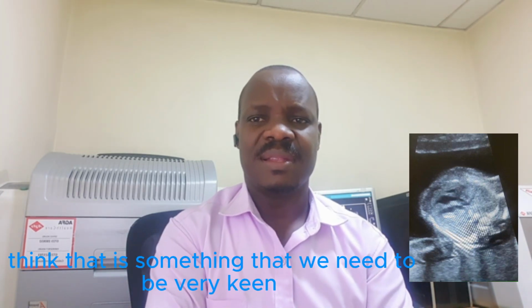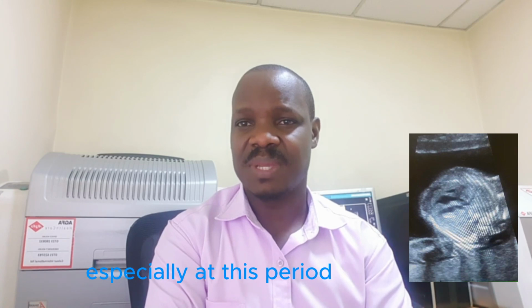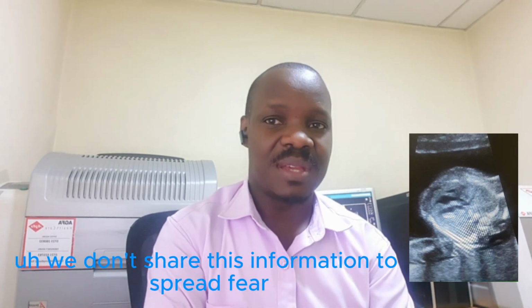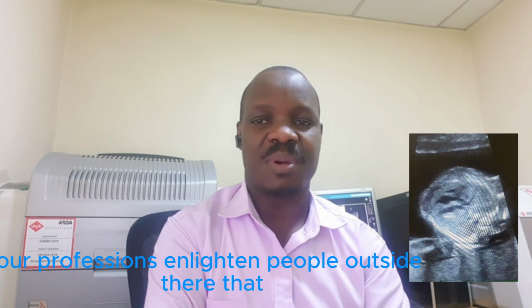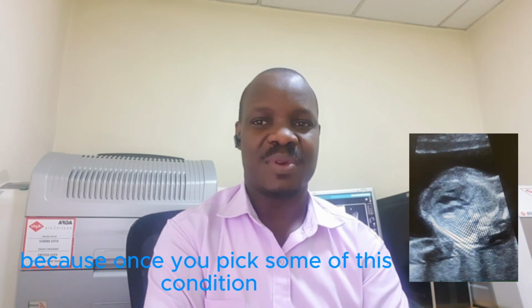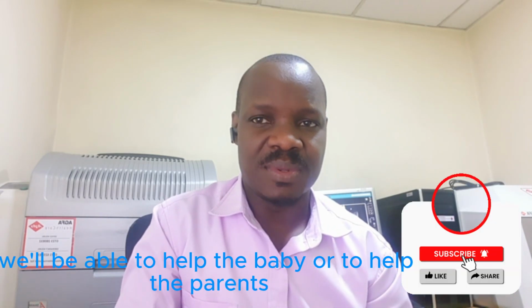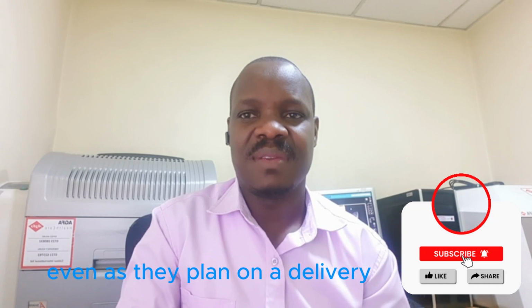I think that is something that we need to be very keen on when doing an anomaly scan, especially at this period. We don't share this information to spread fear. It's just to enlighten our profession, enlighten people outside there, that let us be keen when we are doing this. Because once we pick some of these conditions, we'll be able to help the baby or to help the parents even as they plan on the delivery.